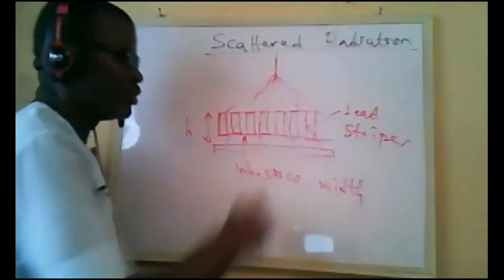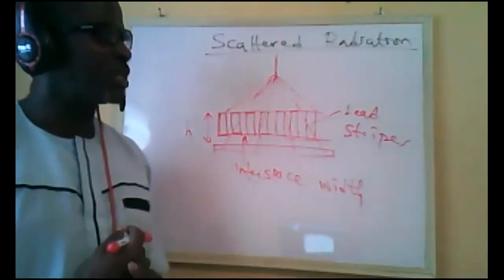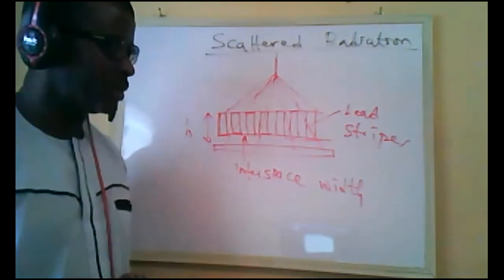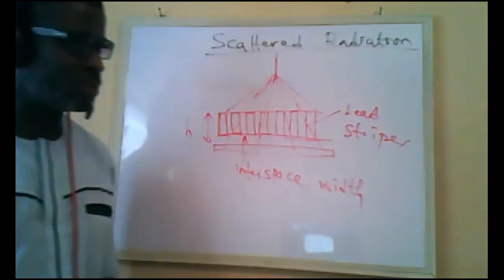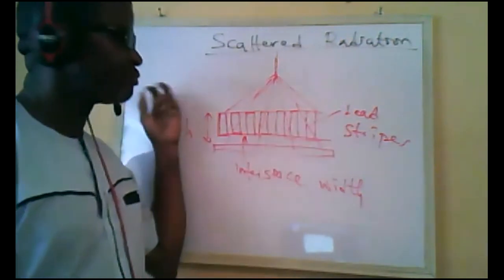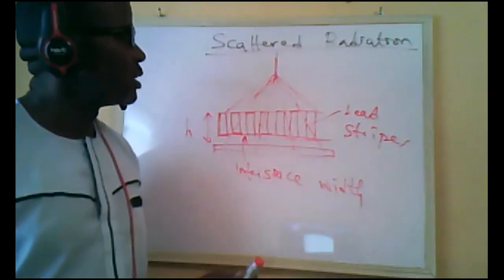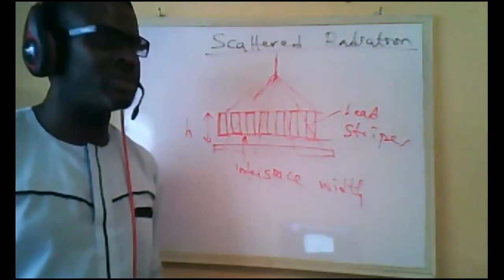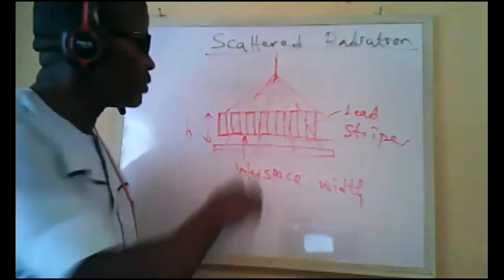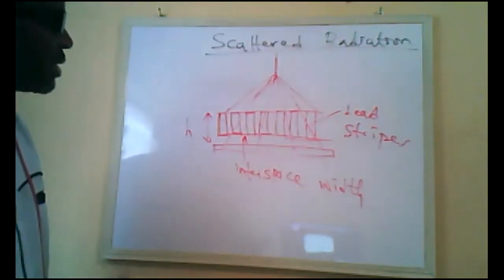So this is going to reduce the amount of scattered photons, which don't contribute anything to our radiograph. They're just there to degrade the image. So with strips and with grids, with lead in grids, we have a greater amount of scatter rejection. Too many scattered photons wouldn't reach our image receptor. So with that, it's an increase.